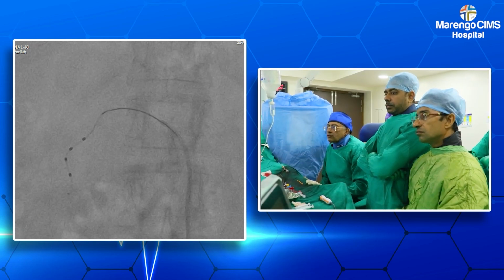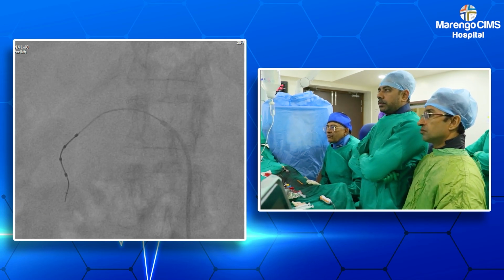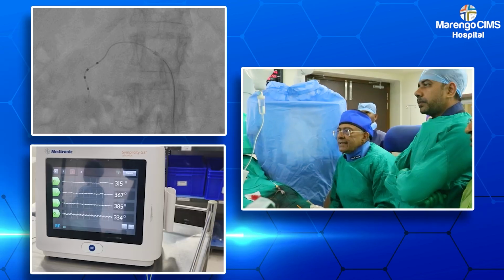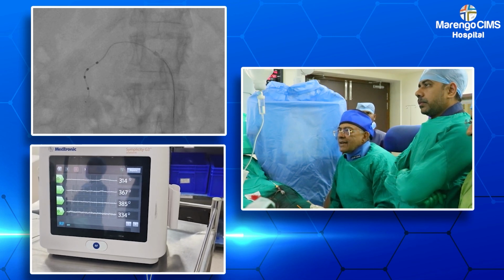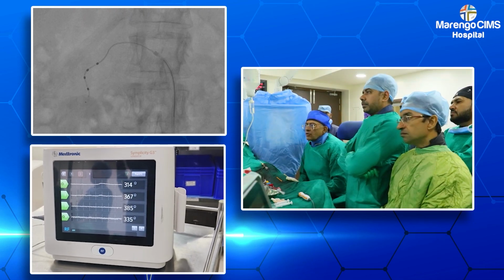Spiral catheter into the inferior large branch. We have placed it in such a way that the distal electrode is about 4-5 millimeter, about 3 millimeter away from the cortex, parenchyma. However, when you see, despite giving nitroglycerin, the proximal electrode area shows some spasm, but probably it is more of a concertina effect which will not go away.